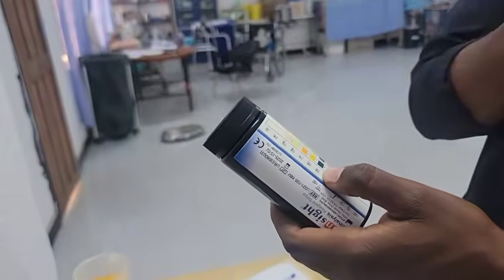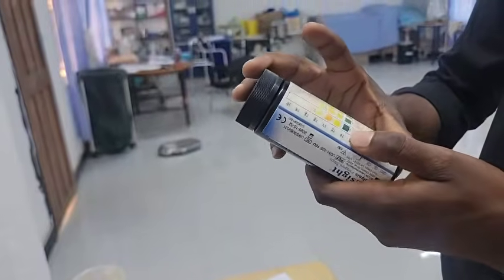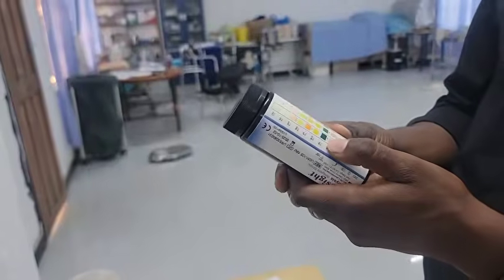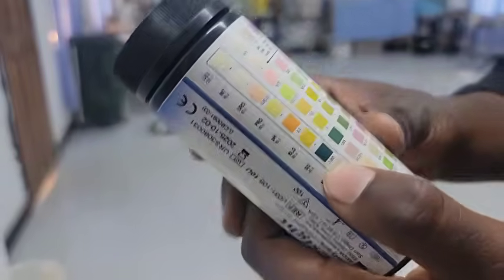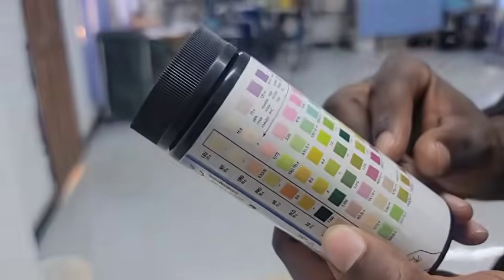Yes. Specific gravity. What of specific gravity? So the normal range is supposed to be between 1.010 and 1.030.